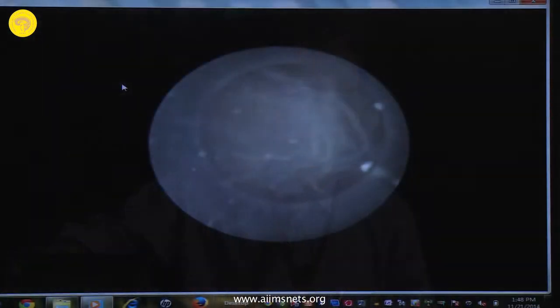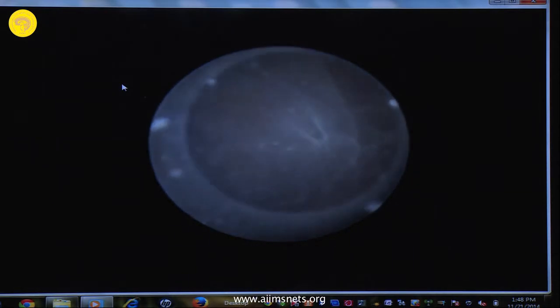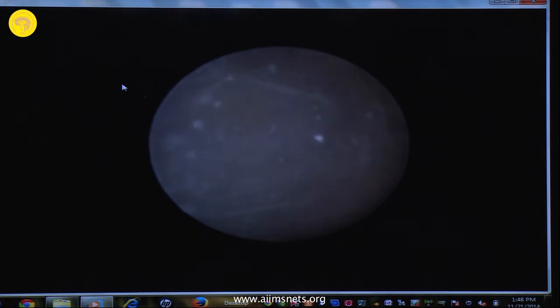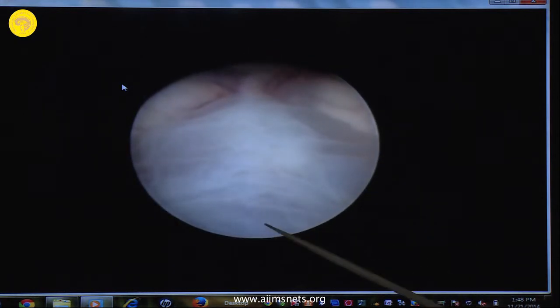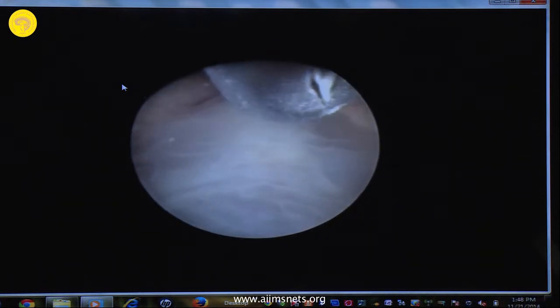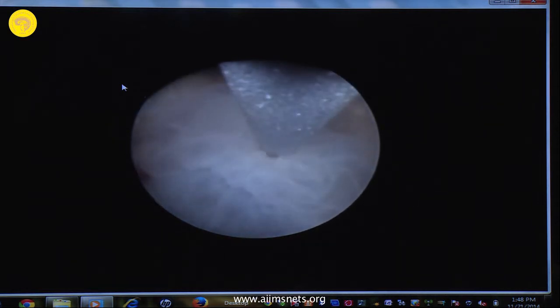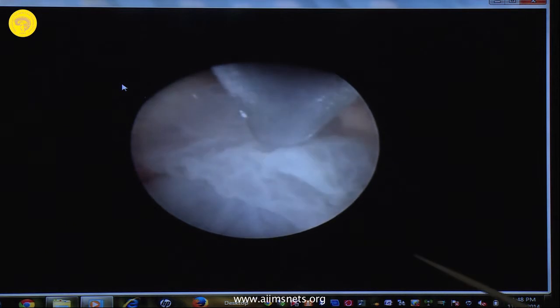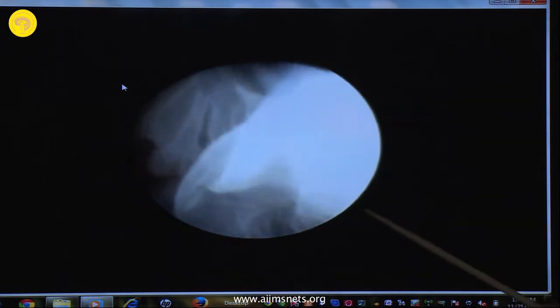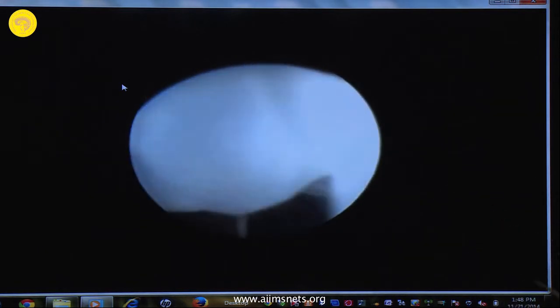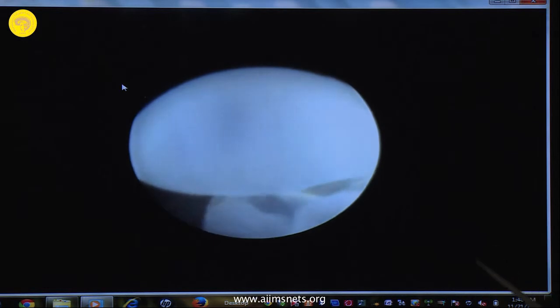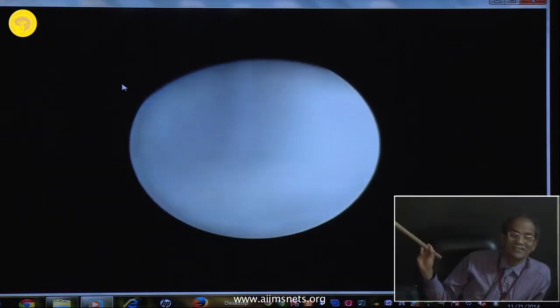I will show you that cyst. When I tapped it, it had already broken, which is why the cyst you are seeing inside is all crumpled. See here — it is lying there, quite a big cyst. See how nicely whitish it is in colour. It is like an epidermoid cyst like this, a very big one — multiple, actually.